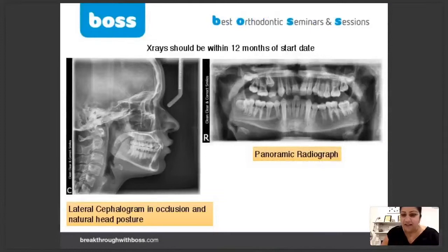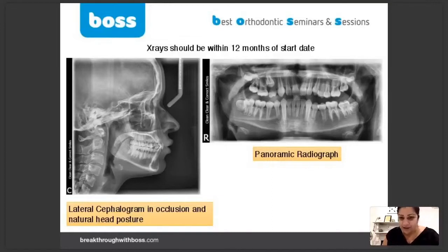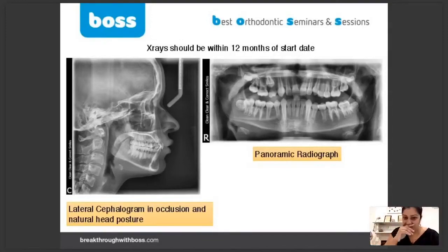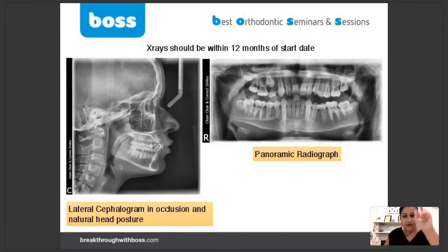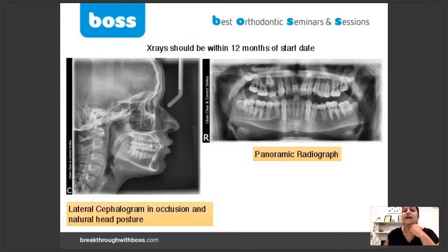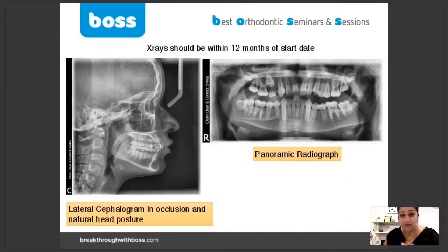This is the basic set of orthodontic records. You need those photographs I just showed you, digital models or study models with orthodontic trimming and bases, a lateral cephalogram — make sure it's in occlusion and natural head posture. The patient just looks as far into the horizon as possible. Sometimes people have a mirror and ask the patient to look into their own eyes — that's natural head position, with the head not tipped up or down, directly level. This is actually a really good cephalometrics radiograph and a really beautiful panoramic radiograph.